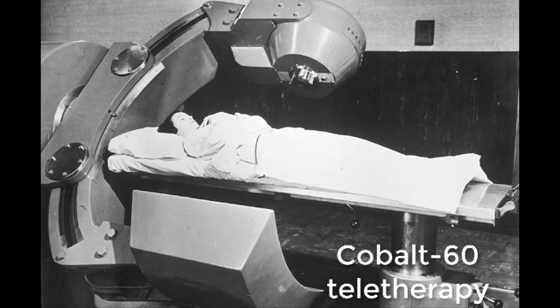The first units were developed in the 1950s. A pioneer of this was Harold Johns at University of Saskatchewan, and there was also a unit built at University of Western Ontario at about the same time, and they treated their first patient in October of 1951.